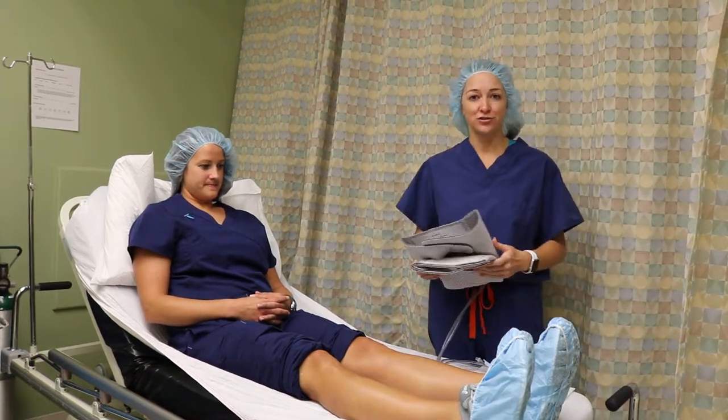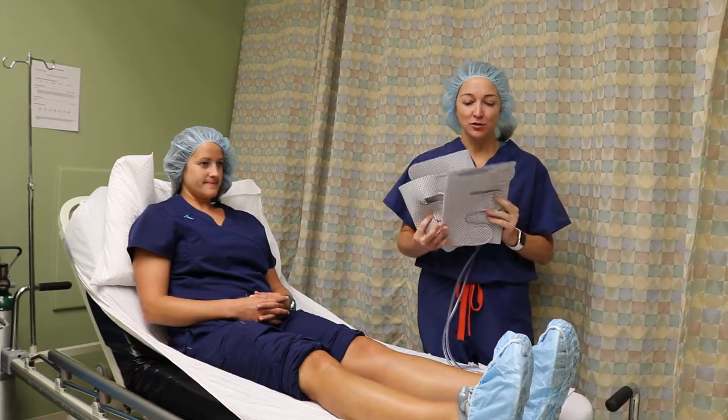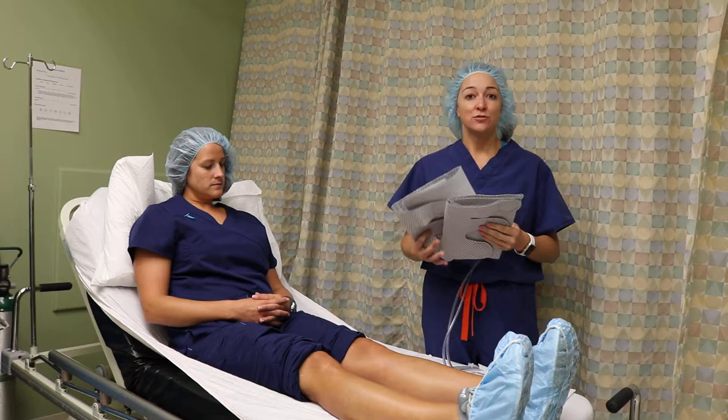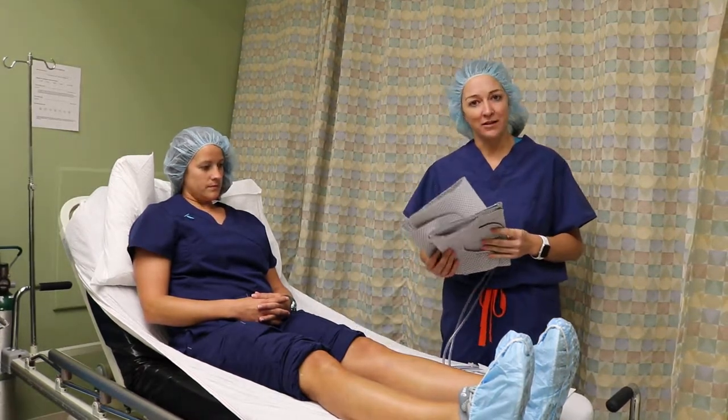All patients, prior to their surgery, we place sequentials on them. These sequentials help increase blood flow while the procedure is going on, to therefore eliminate the possibility of getting a blood clot.